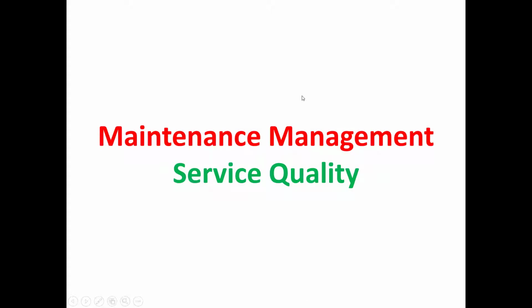So as we can see from the previous videos, the type of technology has changed the philosophy of the maintenance. As we said, now we need fewer IPMs, or inspection and preventive maintenance, because the technology is now more reliable. Also, the intervention from the user as well as the biomedical engineers and the biomedical technicians has been minimized.